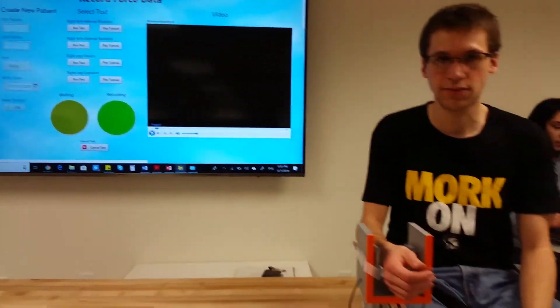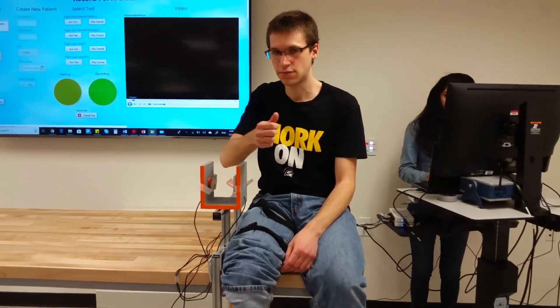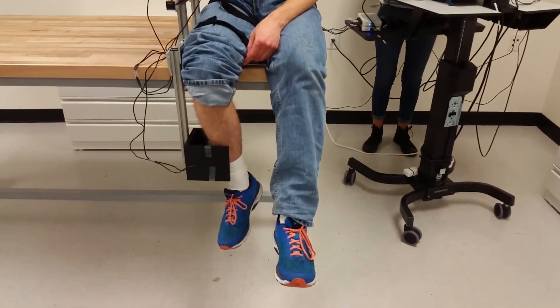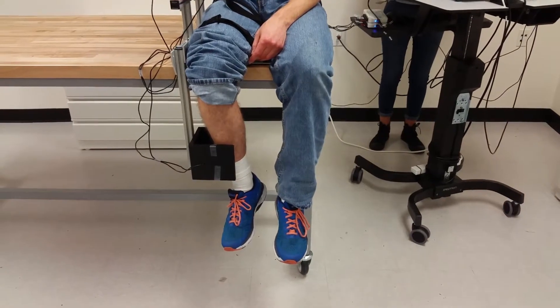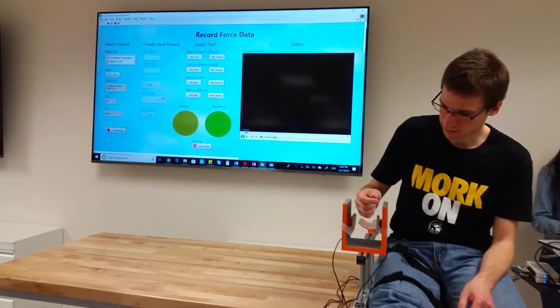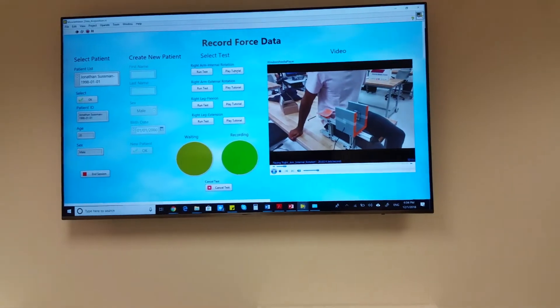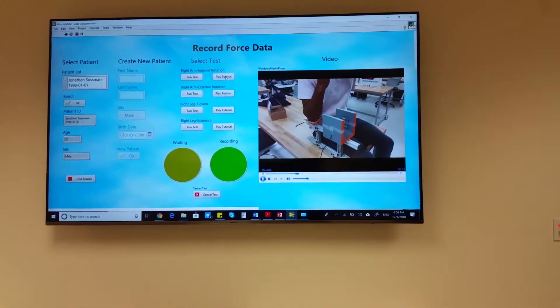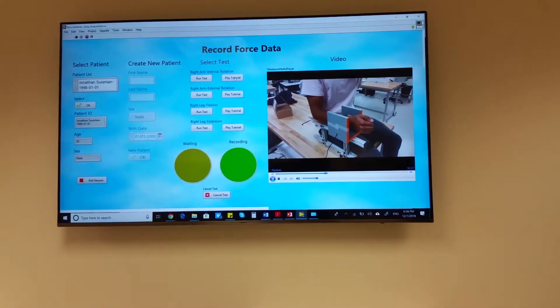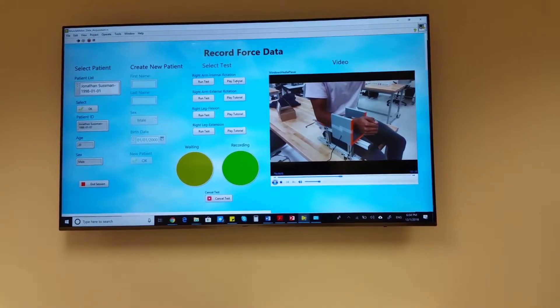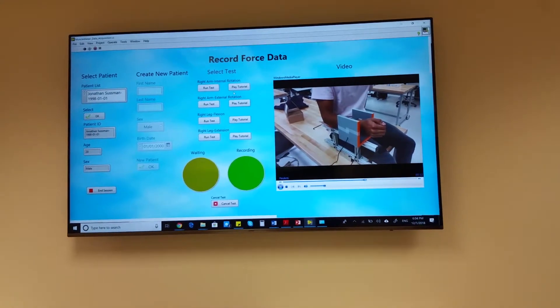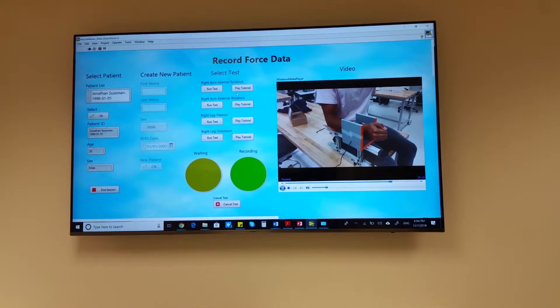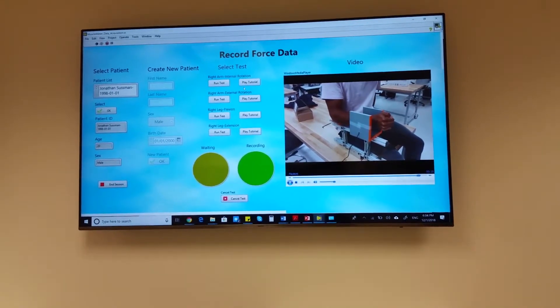There are four different muscle contractions we are testing: internal arm rotation, external arm rotation, leg extension, and leg flexion. The technician will click on the tutorial video to show the patient how to perform the test. Place your elbow on the elbow pad and place your wrist between the two gel pads like so. When you see the yellow light, press your arm towards you as hard as possible while keeping your elbow in contact with the gel pad. Hold for five seconds.